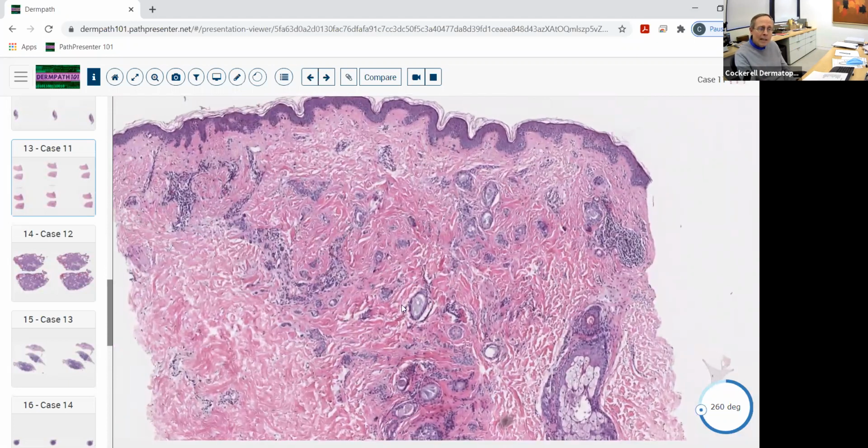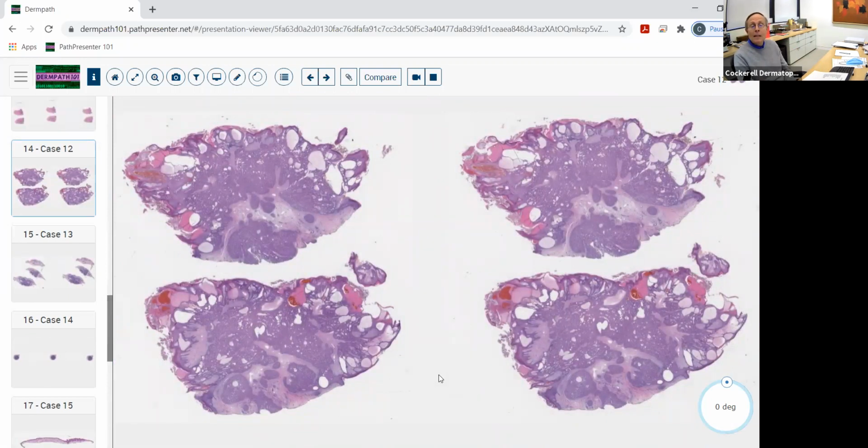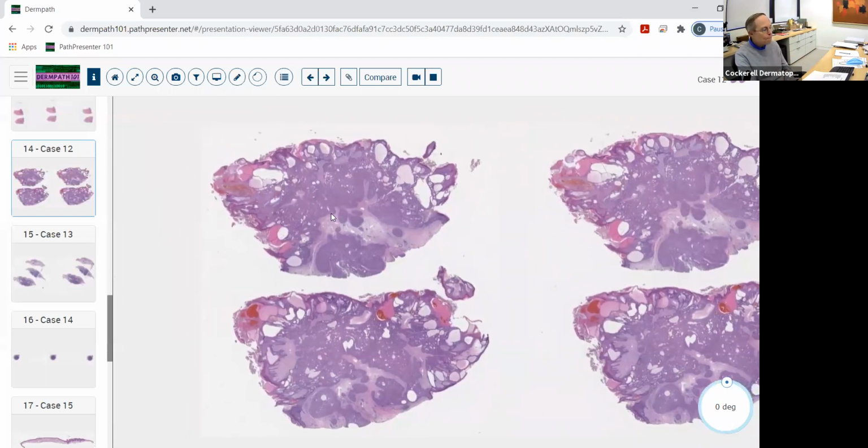Is this apocrine? Is it eccrine? Again, everybody sort of thinks these are eccrine because they're smaller ducts. I don't know. They might even be apocrine. Who knows? But it doesn't make that big of a difference. The main thing is that you don't make it tough to make the diagnosis because the sample's not good. And there's no stain at all that's going to help you there to distinguish that. You need morphology to make that diagnosis and clinical correlation.